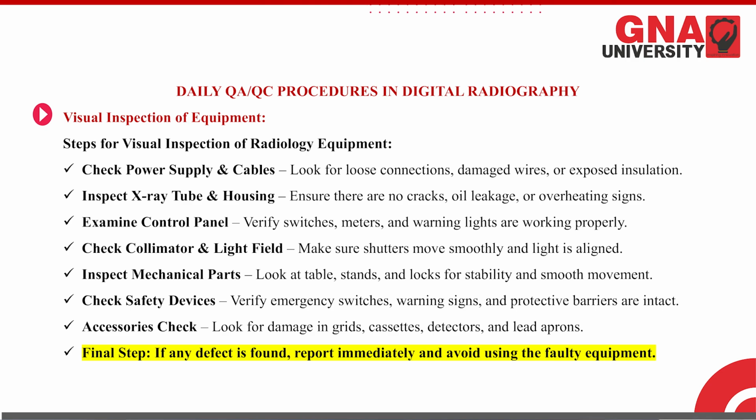And next, we have to check that the protective barriers are intact. We have to check the walls, whether the protective barriers are intact or not. If there is any damage in those protective barriers, that is the lead sheets, any crack, or any other damage in the walls, we have to verify it.